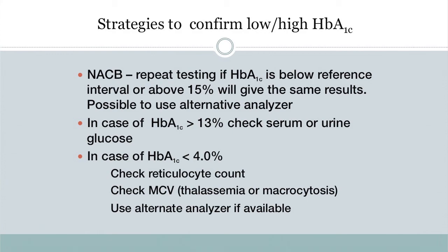When A1c is low — less than 4% — we check the reticulocyte count to see if it is elevated, or whether the MCV is elevated. In patients with beta-thalassemia, the A1c will be about 0.4% lower than a similar patient with the same glycemic control, due to increased red cell turnover. It is useful to examine CBC results to help explain why A1c is high or low.